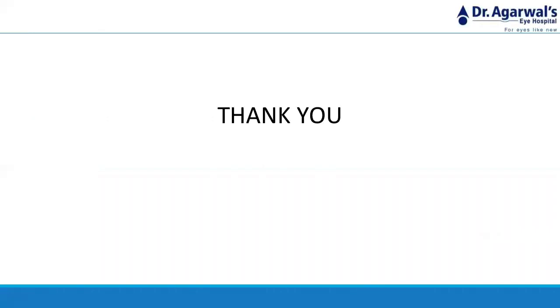We also have displayed the low vision aids over here. So people who are interested can come after the class and you can get to know about the various devices. Most importantly, the cost of all the various devices, because as he was telling, one is the cosmetic acceptability and the other thing is about the cost of those devices. So patients generally have a hindrance when it comes to the cost and the way it looks. So these 2 factors need to be considered.